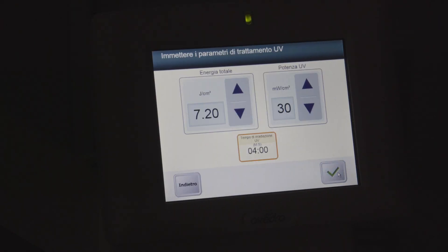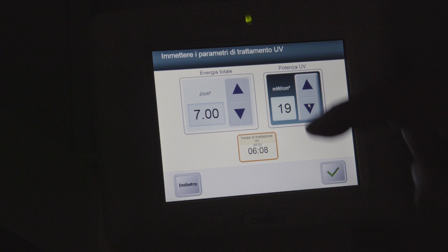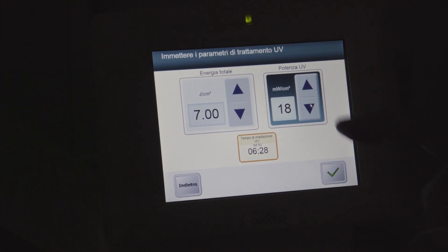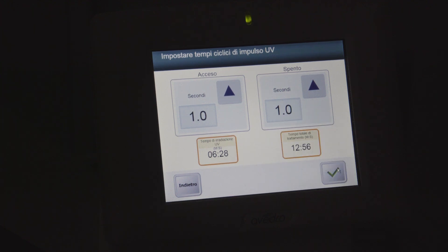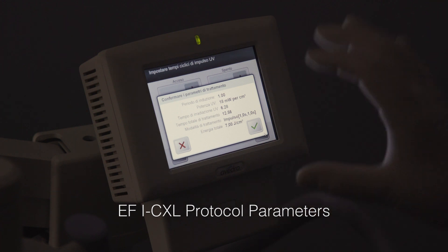We use the pulsed light. The fluence is 7 joules to compensate the presence of the epithelium in situ, which absorbs 30% of UVA fluence at 370 nanometers — the wave band used for cross-linking. We want to complete the treatment in about 20 minutes, so we set the UV power to deliver the 7 joule dose at 18 milliwatts. We have a radiation time of 6 minutes and 28 seconds, pulsed with 1 second on and 1 second off, so the total treatment UVA time is 12 minutes and 56 seconds.